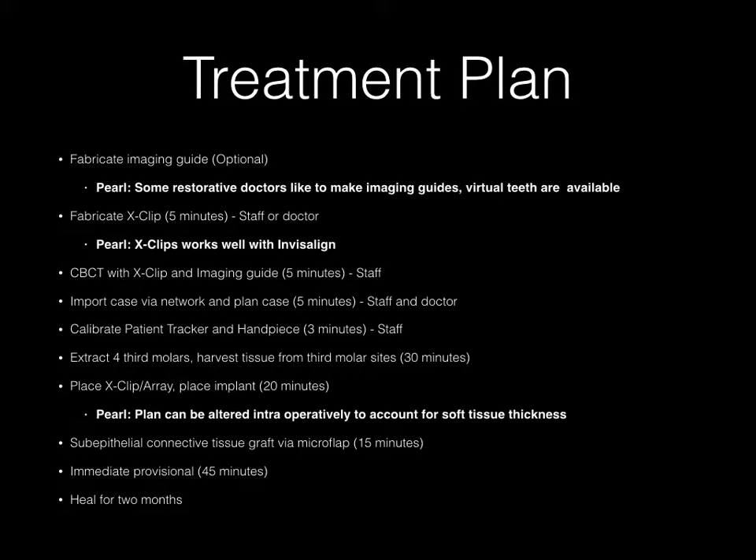One of the ideal things about using the X-Guide is that the treatment plan can be altered intraoperatively to account for soft tissue changes. In this case, a connective tissue graft is going to be done and it's a highly aesthetic case, so I'm going to want to account for vertical changes and intraoperative observations at the time of surgery — and I can change those with the X-Guide. I'm going to do a sub-epithelial connective tissue graft via a micro flap, immediately provisionalize the case, and allow it to heal for two months.